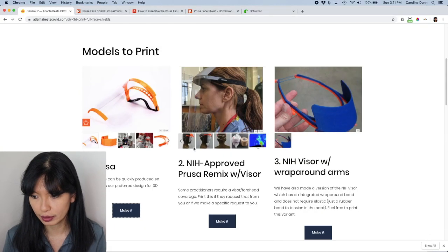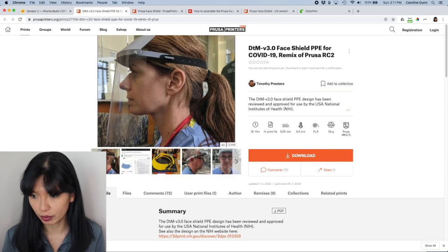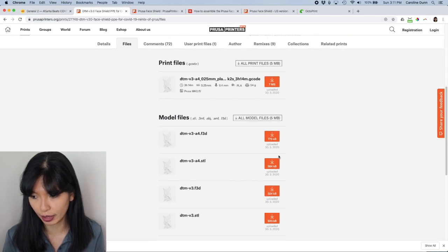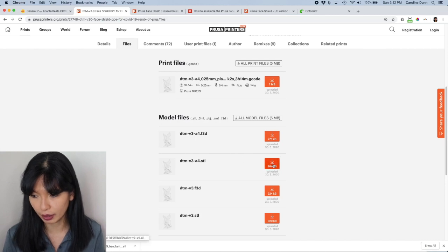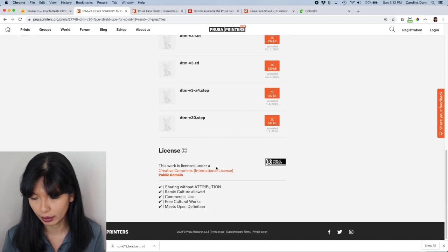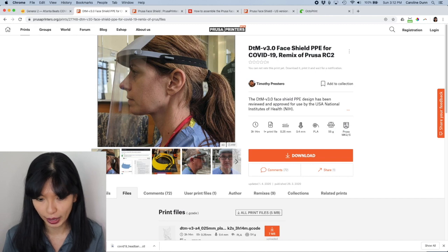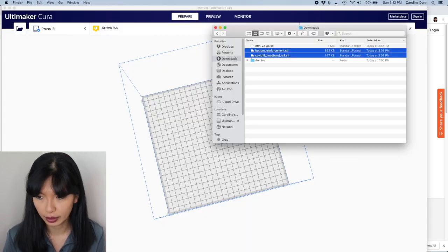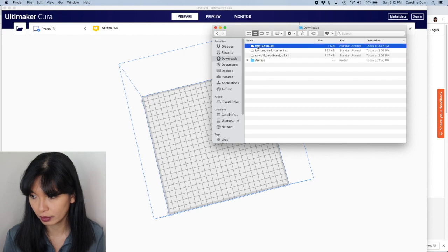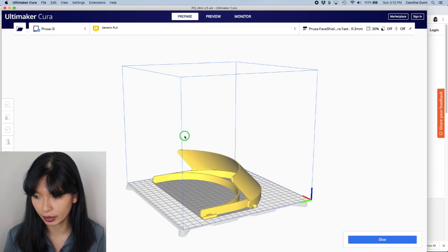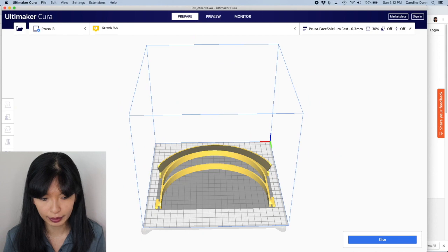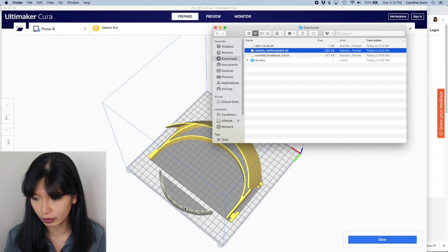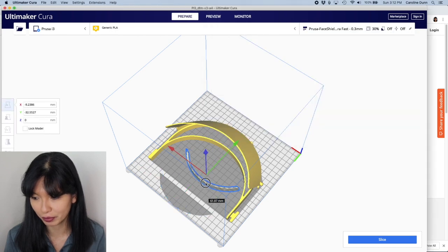Let's go back to the ABC website. This is the NIH approved Prusa Remix with Visor. And so you can see it here. You can hit download. The process is the same. And I'm going to show you, I'm going to hit the STL. I'm going to download the STL file and then go back to my Cura, go back to my downloads and there it is and drag and drop it. And there it is. And if you want to add the bottom reinforcement, yep. You want to drop that in there as well and make sure it is part of the print.